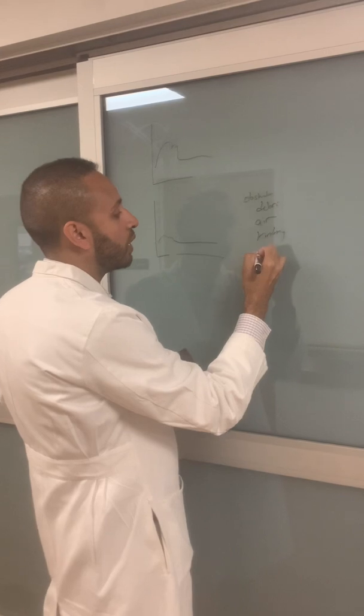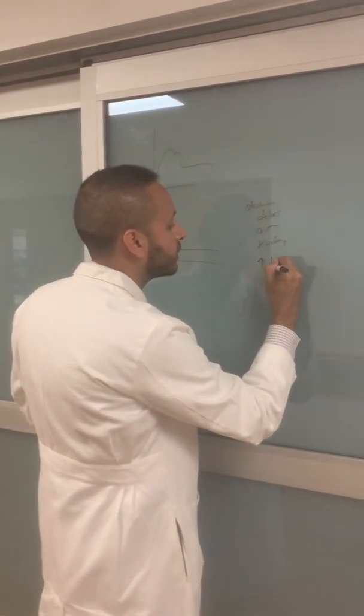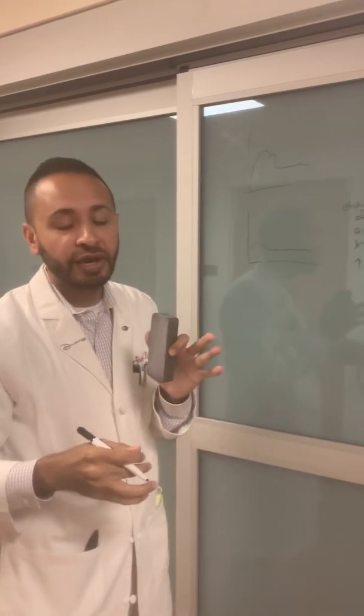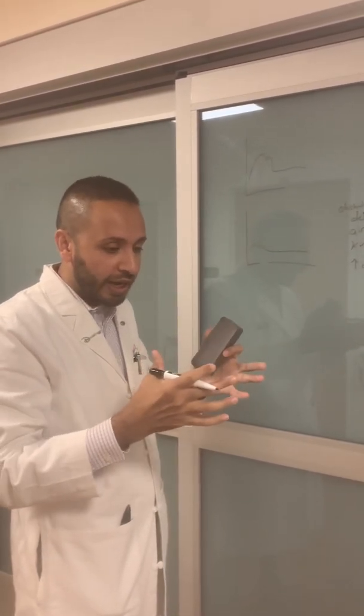Also, when you have drained a lot of fluid, with increased drainage, the amplitude of your waveform may be decreased compared to prior because the brain has not rebounded as much.